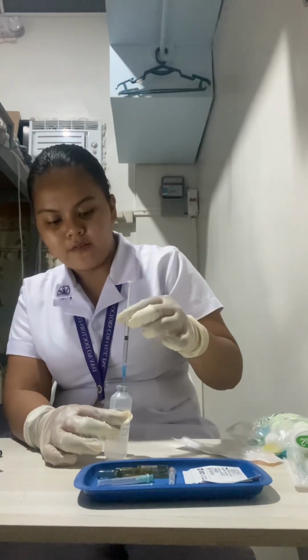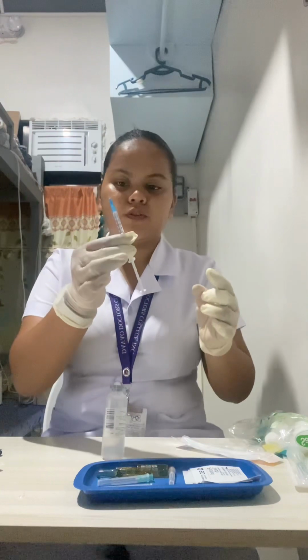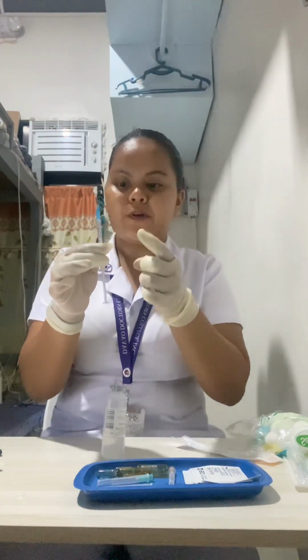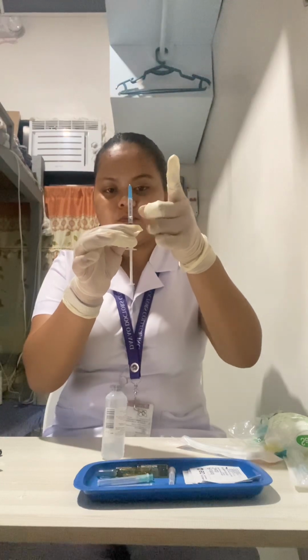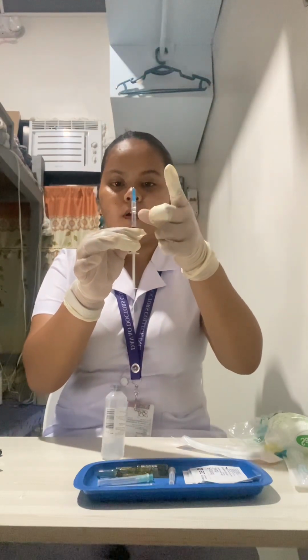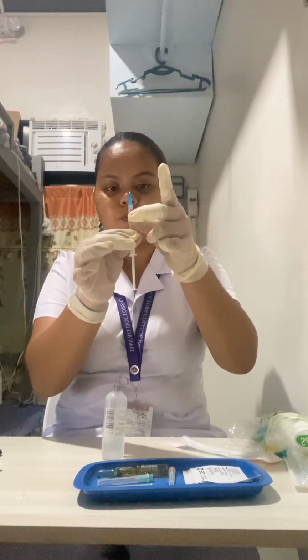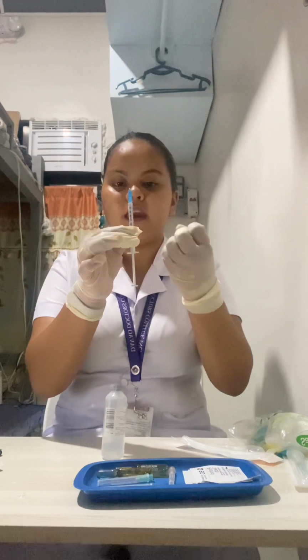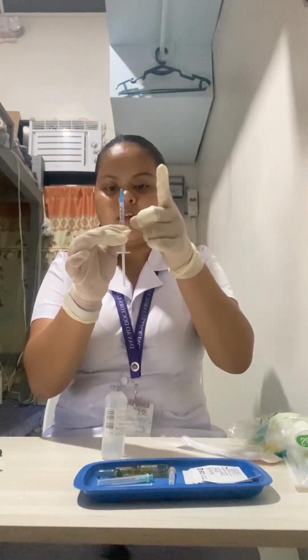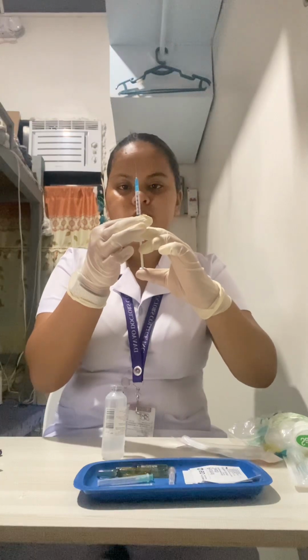So now I have here a medication of 0.5. If necessary, we can slightly tap the syringe so that if there is any air or bubbles present, we can eject it, because it will help to raise the air and the bubbles present in the syringe. So now I'm going to slowly eject the air.